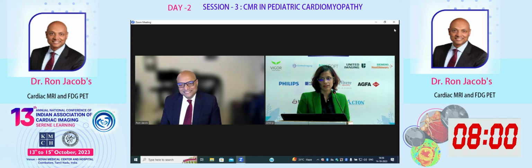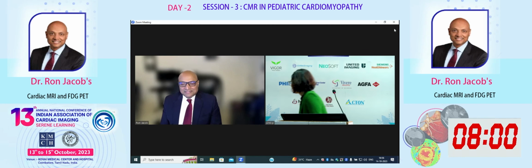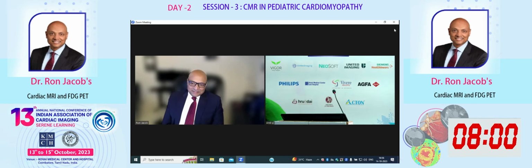That brings me to another question here. When should we be repeating our mapping values? We have a scanner which we got 5 years ago, and we have given T2 mapping values. The platform gets upgraded now and then. So should we be repeating our normals?